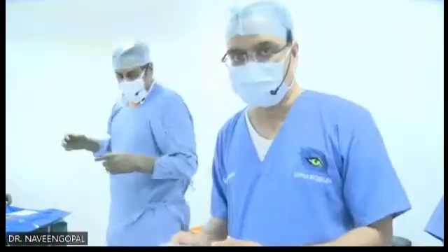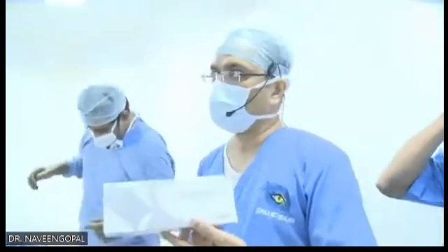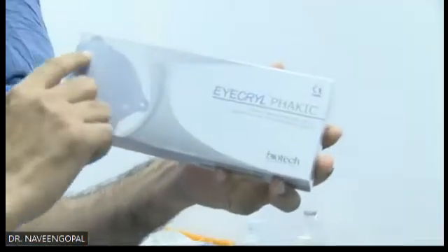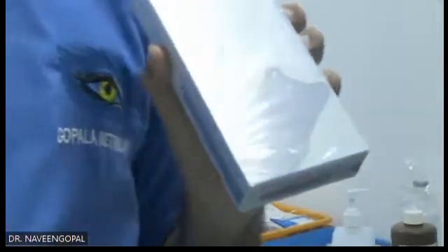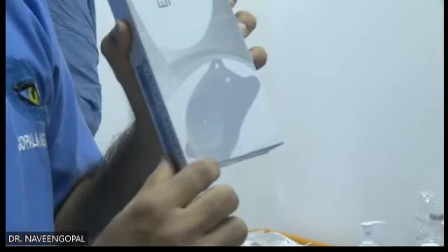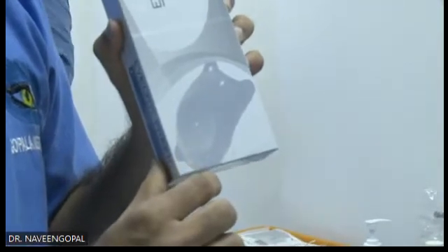First and foremost, we need to see the box which comes. This is a phakic IOL, non-toric phakic IOL. You can see here the leading haptic will have a hole towards the left side. We will show that even on the microscope. The leading haptic will have a hole towards the left side, and the trailing haptic will have a hole towards the right side.